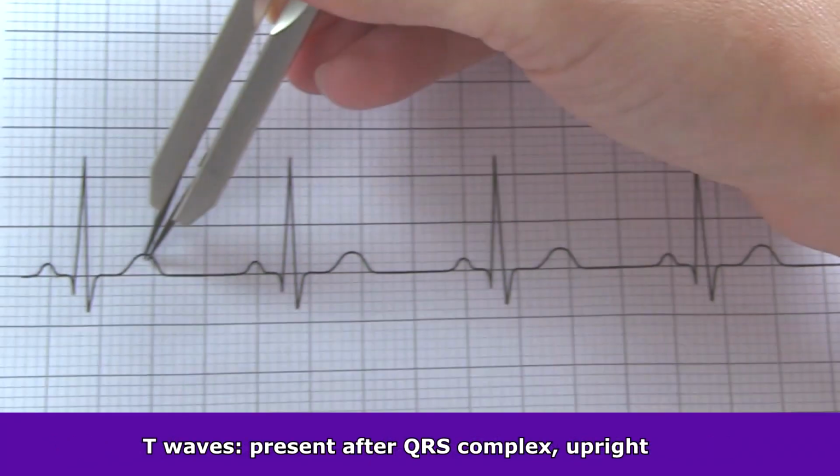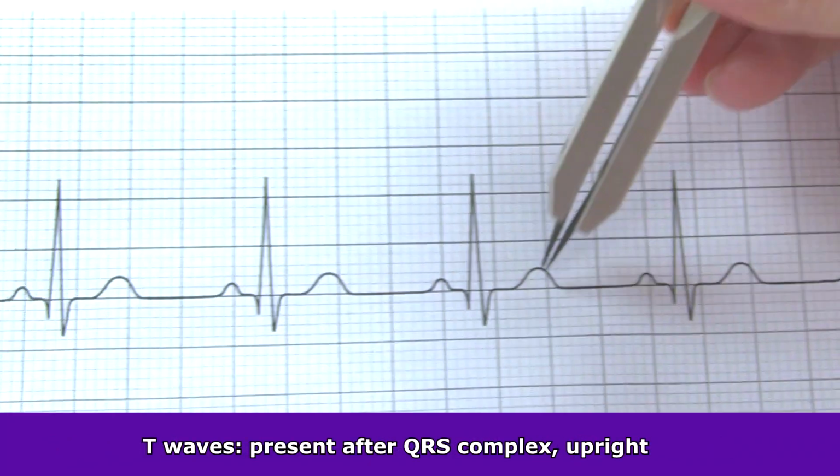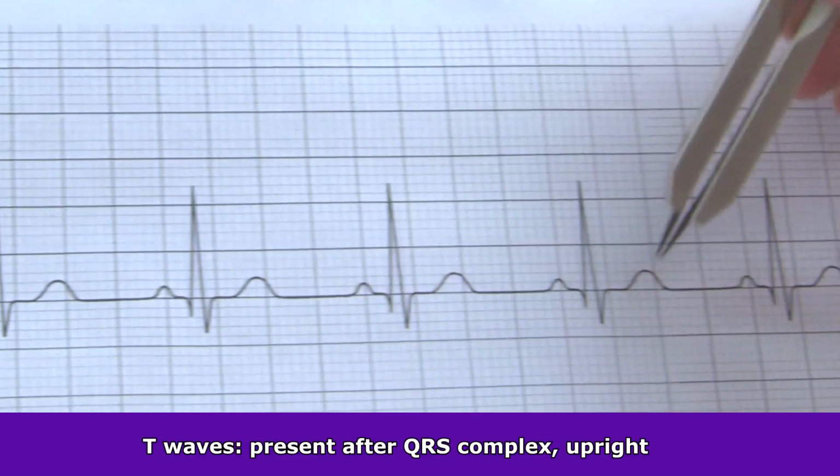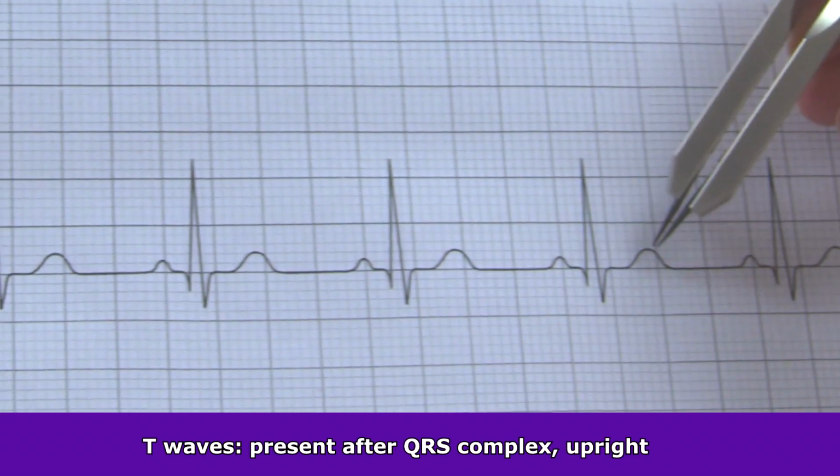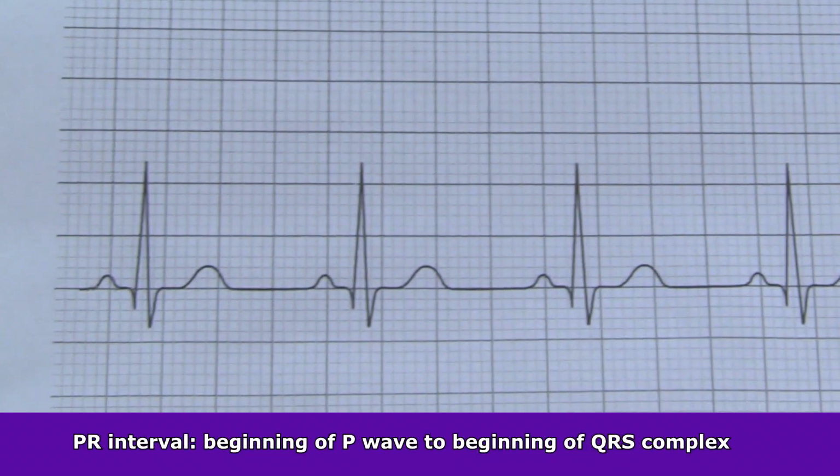Then look at the T waves. Make sure there's a T wave present after every QRS complex and that it looks like a T wave. It's where it's supposed to be. It's upright. And then lastly, we want to look at the extras.